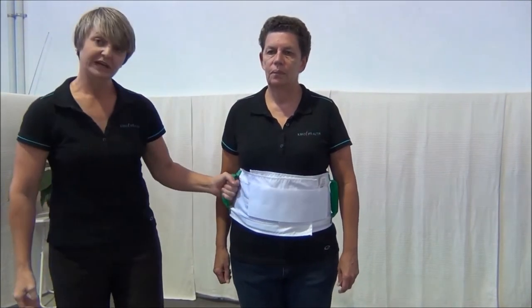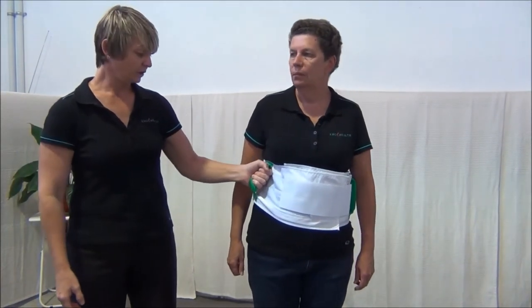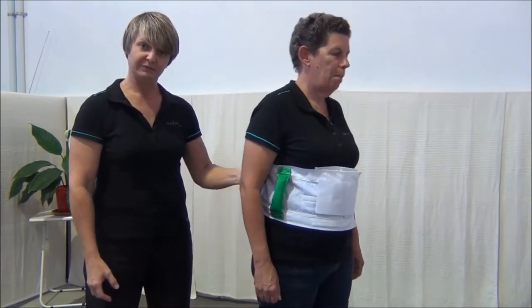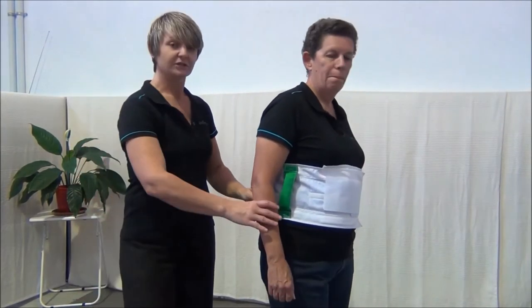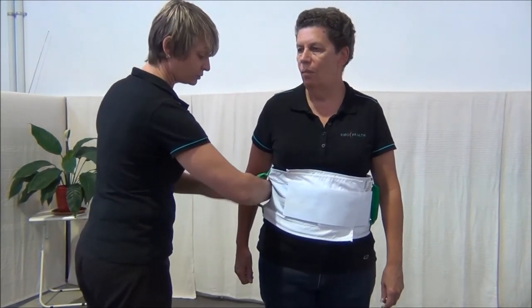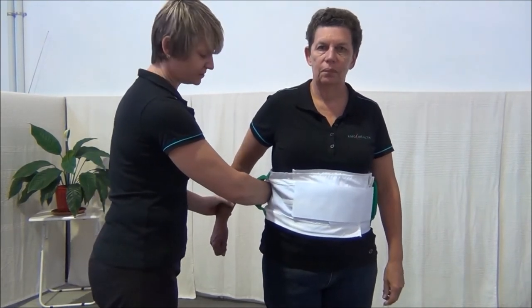You never hold a handle like so — this does not give you any control and the client can fall. You'll also never hold it at the back for the same reasons. And under no circumstances do you place your whole hand under a walk belt and grab the rear strap, as this places both people in a very compromised position.